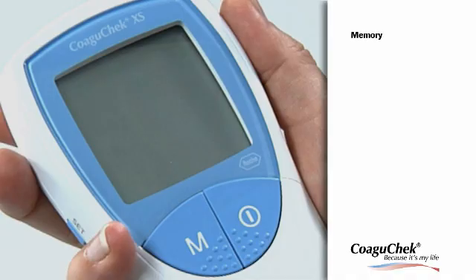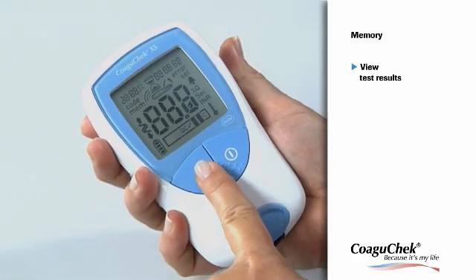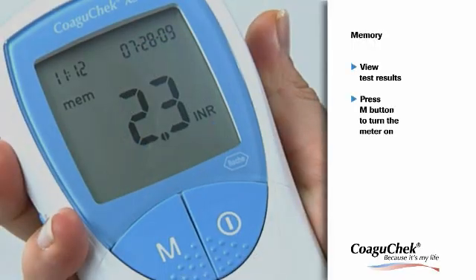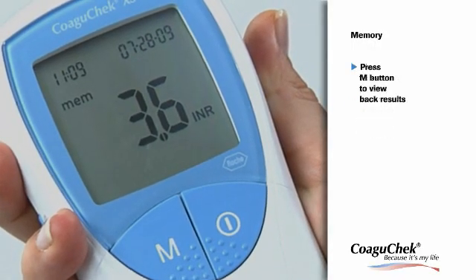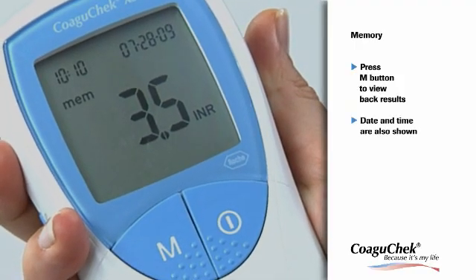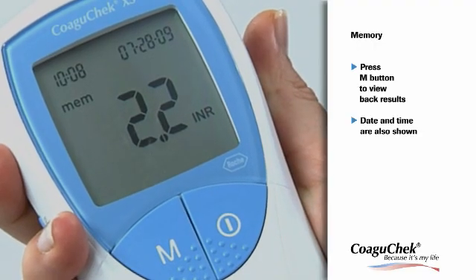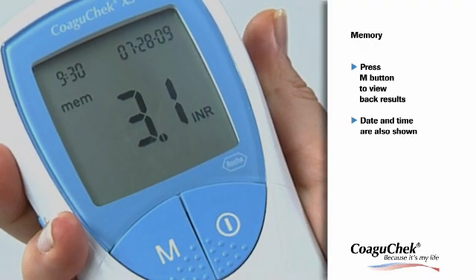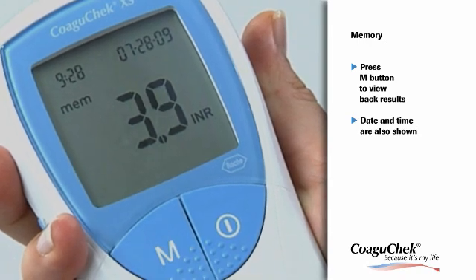The CoaguChek XS meter has a 100-value memory for saving results along with their time and date. If you wish to view the last results, press the M button to turn the meter on. To view back results, press the M button. Date and time are also shown, making it easy to enter test results in your coagulation diary and for your doctor to interpret the values — so you can be confident that your therapy can be optimally geared towards your needs.